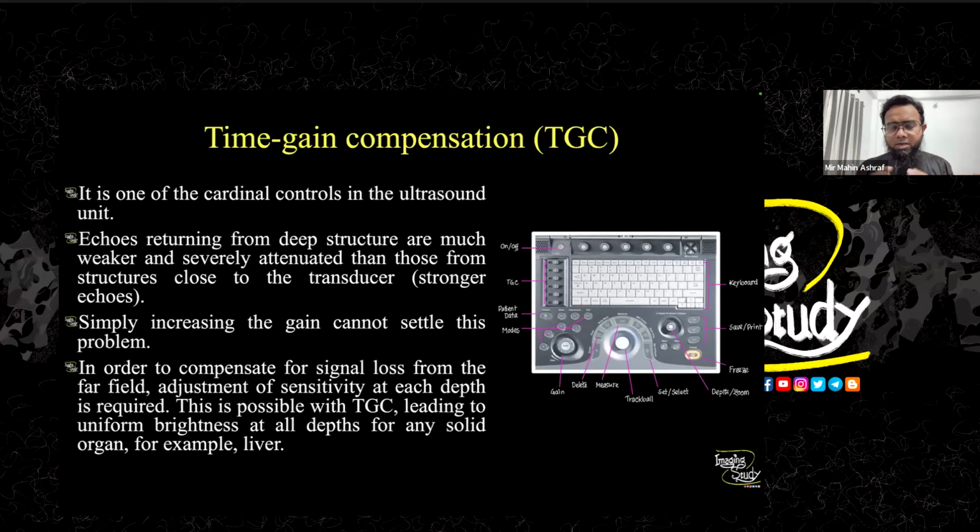So for this purpose, to change the gain at different parts of the screen, we have the time gain compensation option that is called the TGC. You see in your machine, there are some buttons here. I see people playing with these buttons, and these are the most common buttons to get destroyed or stop functioning in a machine very frequently, because the doctors are very depressed, so they just change them for playing games, and they do like this and they damage the button. So don't play with these buttons.